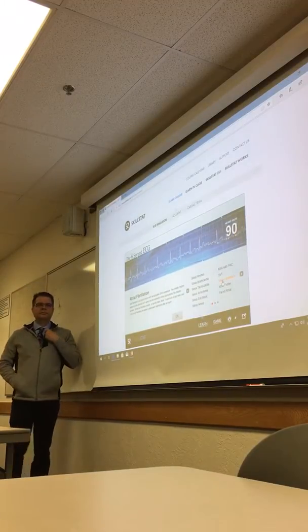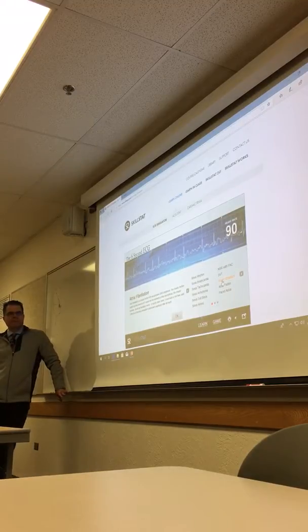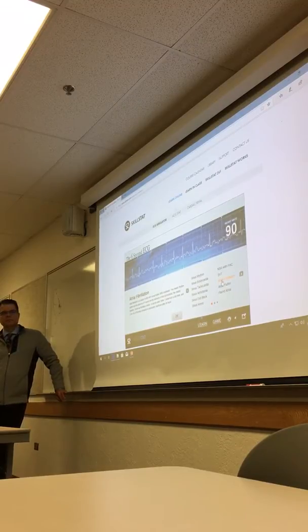One help on that is when you're on the fourth floor and you go over to the monitor, if the strip that you're looking at is yellow, they're in AFib or A-flutter. If it's pink, it used to be orange, but I think it's pink now, it's going in and out of AFib and A-flutter and normal sinus. Or it was in AFib and now we're in normal sinus. If it goes back to AFib, it'll go back to yellow. So if it looks really fine, but it's yellow, print it out and look, the underlying's still gonna be fib or flutter.